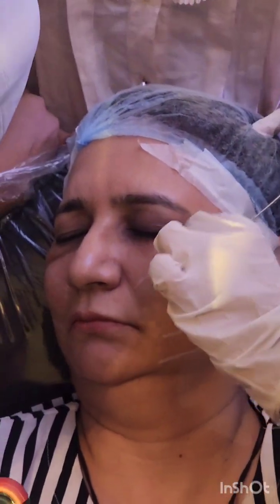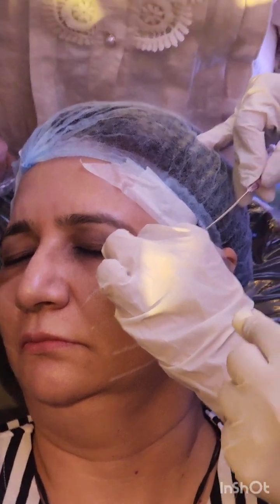Now slide the skin over here. No, don't pull back. Just go. Pressure.